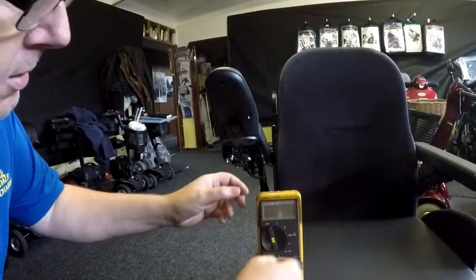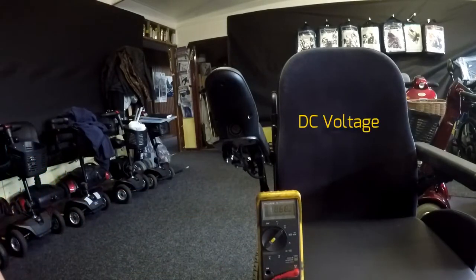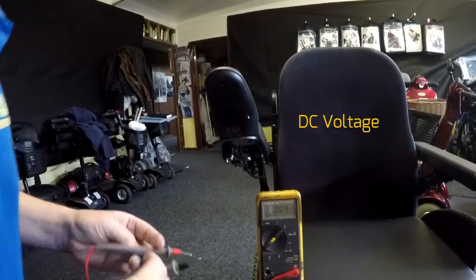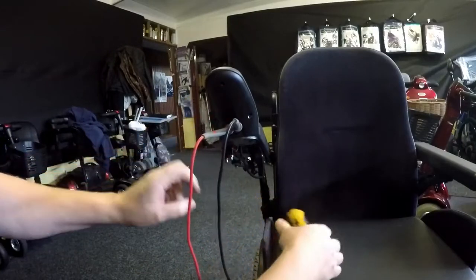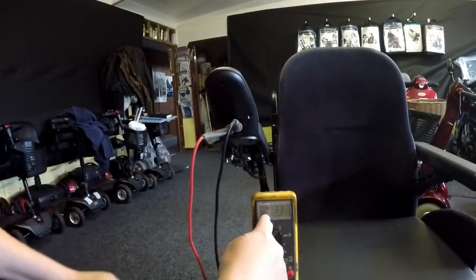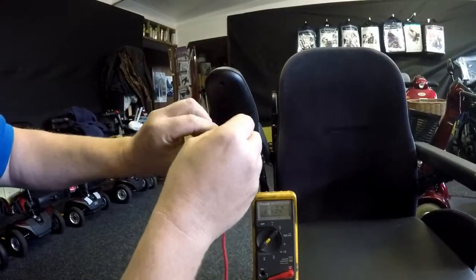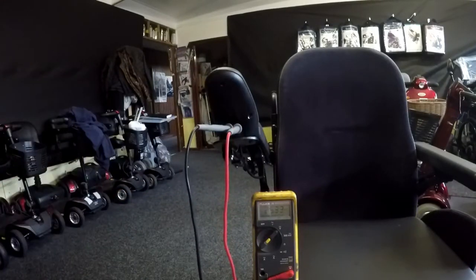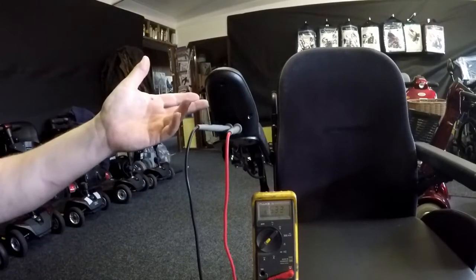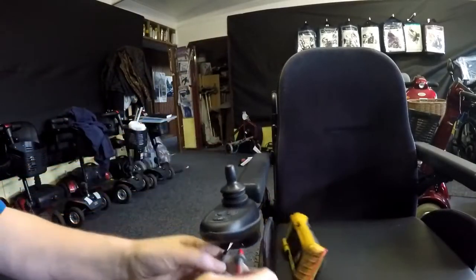Right, as we've got my voltmeter here, I'll put it down to the voltage sign here, and I'll put it on the outside. It doesn't matter which way I put it on, because my voltmeter will tell me, oops, there we go, minus 25, so positive on this side, negative on that side. You'll do no damage whatsoever. So we know there's 25.3 volts in the batteries, say two 12 volt batteries on this particular model. So we know there's power getting here, but it's not switching on, possibly a faulty VR2.